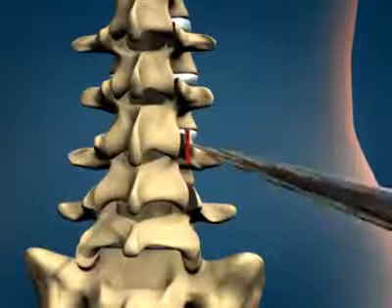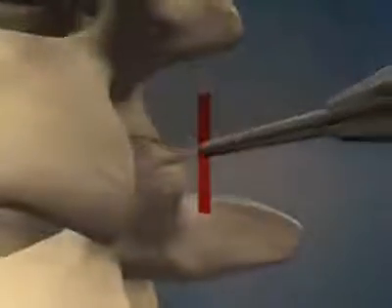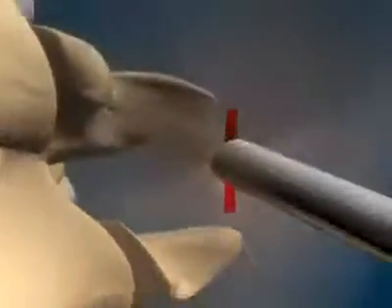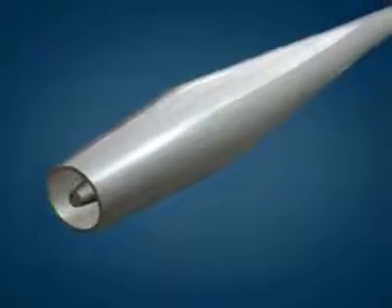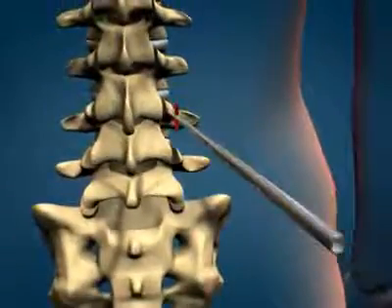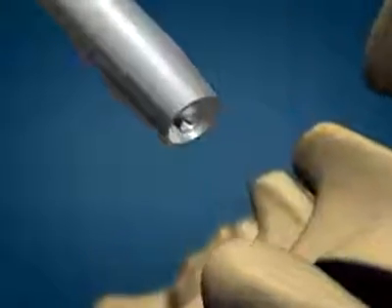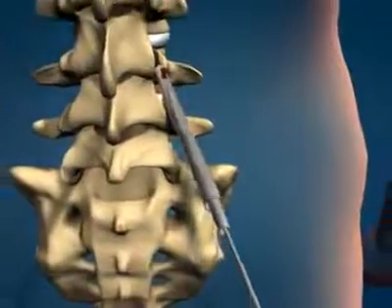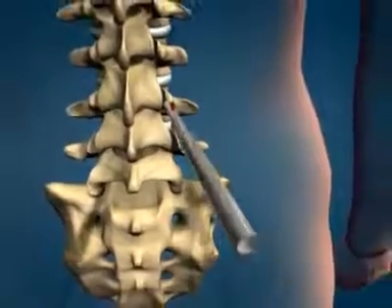Once the guide pin is in place, dilation tube one is inserted over the guide pin and down to the facet joint. Then dilation tube two is inserted over tube one down to the facet joint. Then dilation tube three is inserted over tubes one and two down to the facet joint.